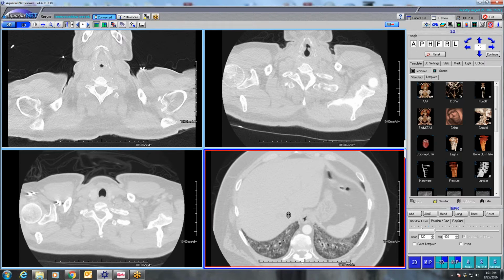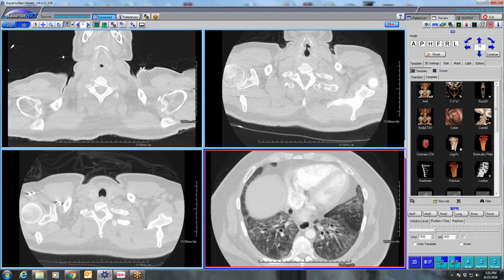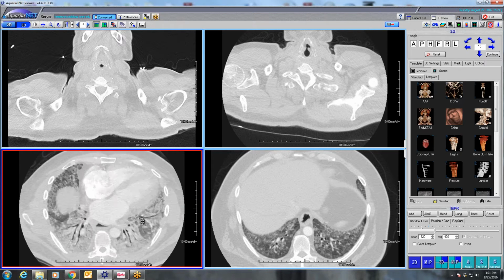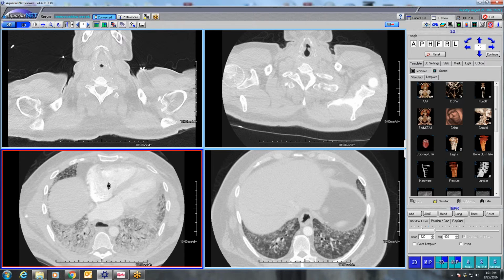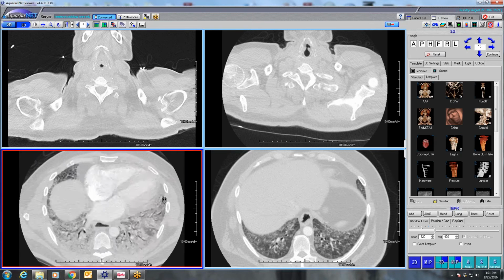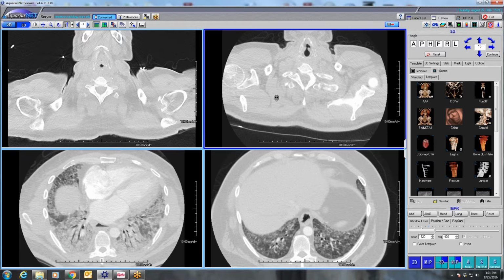And sure enough, this guy underwent open lung biopsy, which showed NSIP with organizing pneumonia. Then he progresses, and this is a few months later, develops more consolidation. Actually, so here he was here. Here he developed more consolidation. This is when he was biopsied and had NSIP with organizing pneumonia on biopsy.